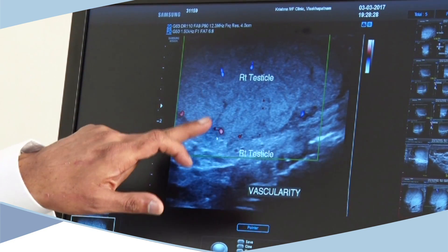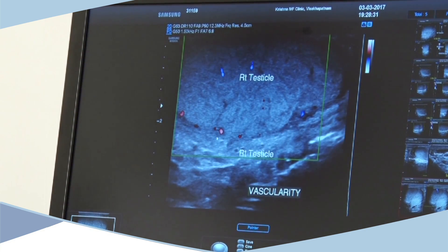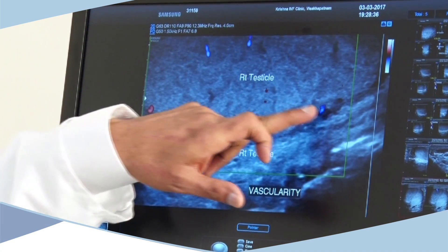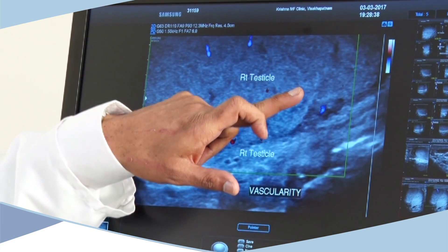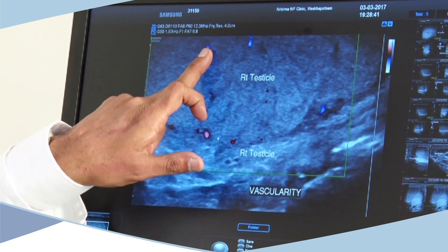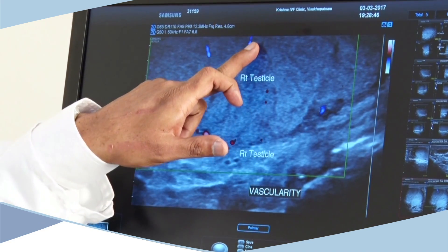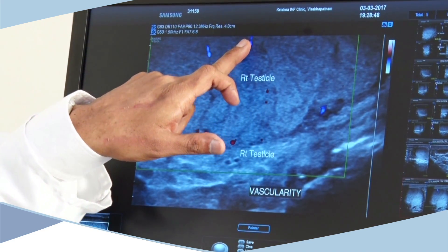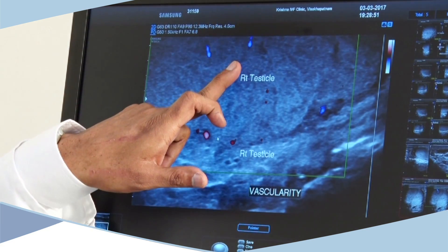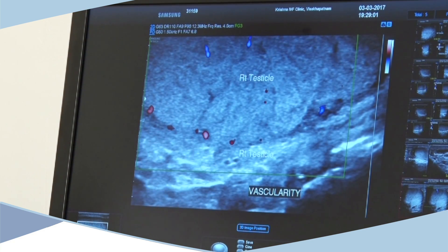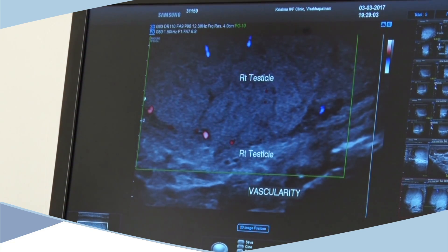Using this probe, you can visualize the blood flows of the testis and magnify it to see the small vessels. In cases with absence of sperm, the presence of vessels can indicate that sperms may be present in that particular area. Taking a biopsy at that region helps us to pick sperms in non-obstructive azoospermia.